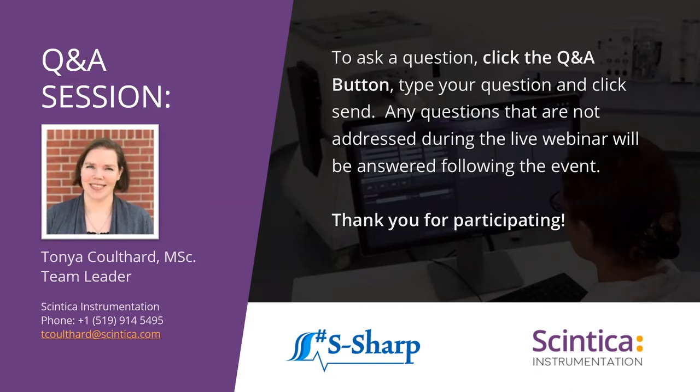So again, it just depends on the anatomical structure that you're looking at, the depth of it, and what you need to see. Okay, perfect. I think those are good questions that we can answer offline if anyone wants some more information.